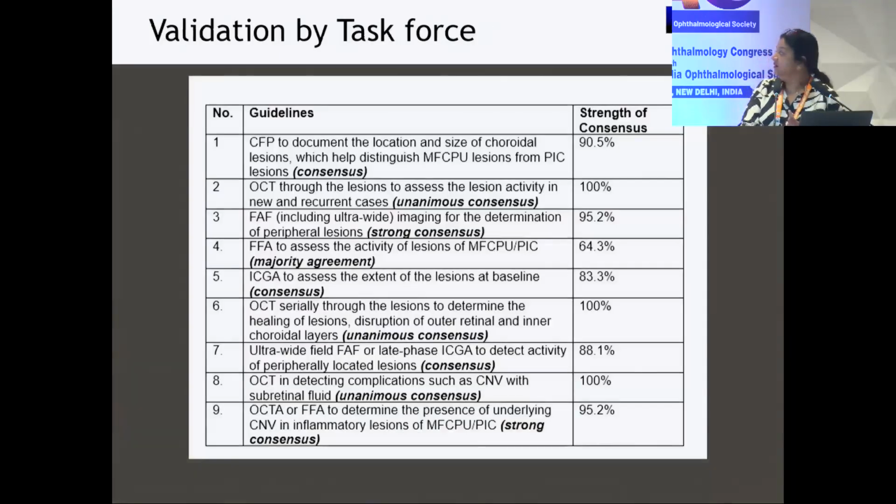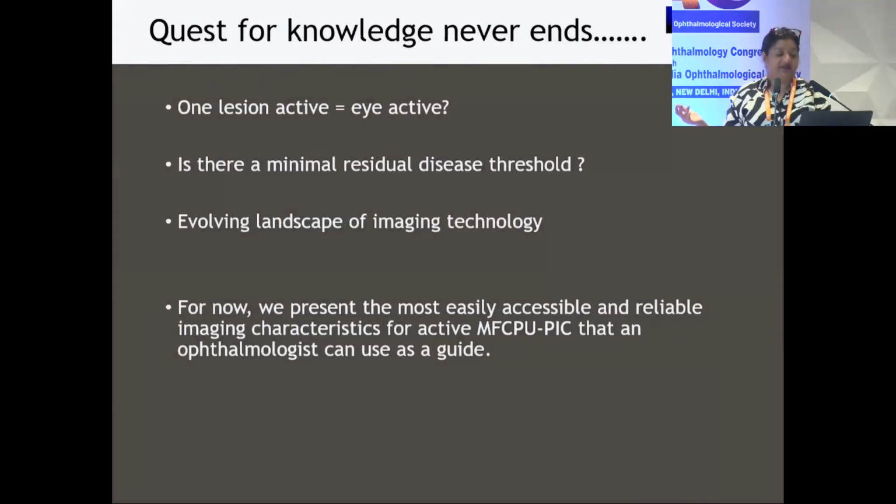Anterior chamber and vitreous cells. Okay, so we make those recommendations that OCT is really helpful. Color photographs can be used as clinical exams, so not very useful. Fundus autofluorescence, very, very beneficial. And then when we sent it to the entire group and asked them to vote, you can see here that OCT and autofluorescence got the highest level of consensus for what you would use, but all the other modalities got lower consensus, pretty much similar to what we had said.